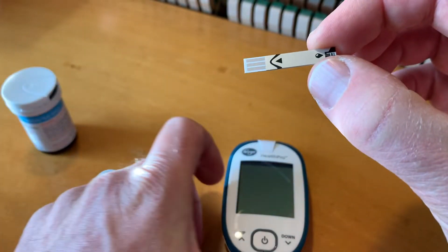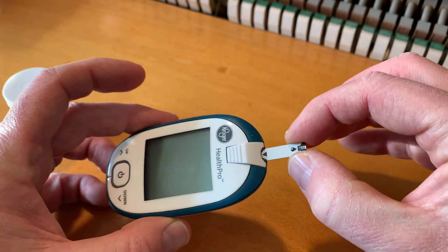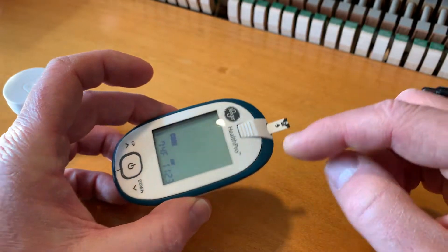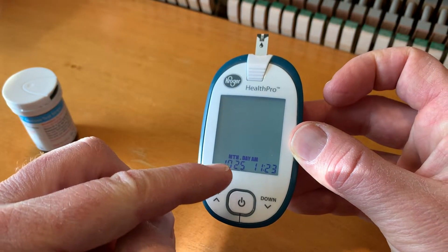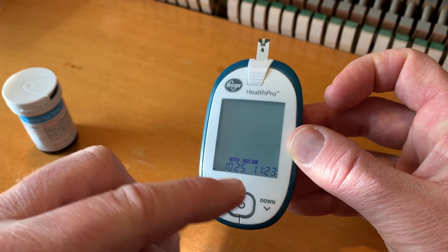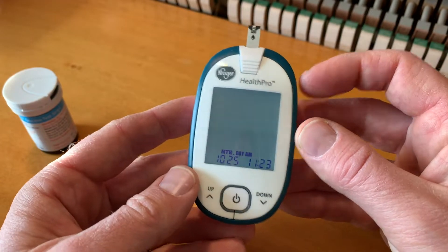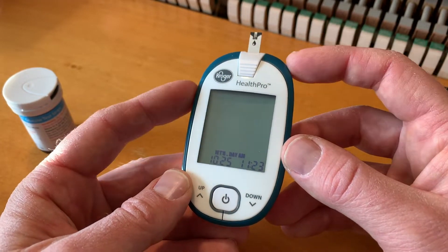We need to insert this strip just like this, with this side up, straight into the monitor. Once you push it in, you can see that it automatically comes on. You should have your correct date and time shown — that's important for tracking the specific time you've taken this test, so you can look back on it.